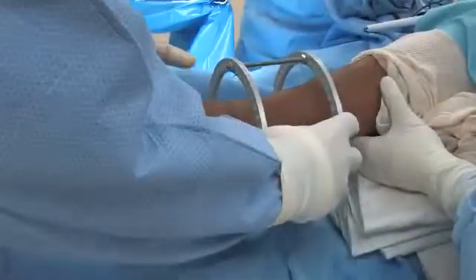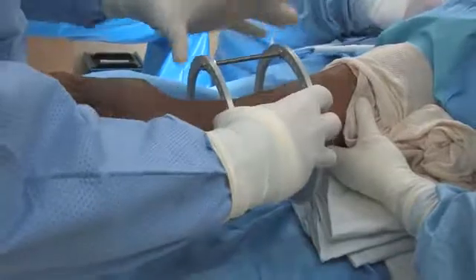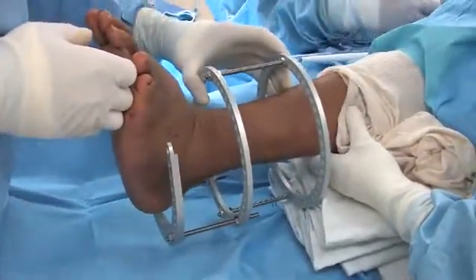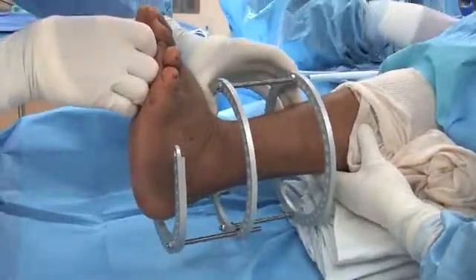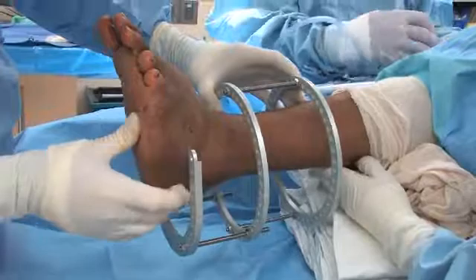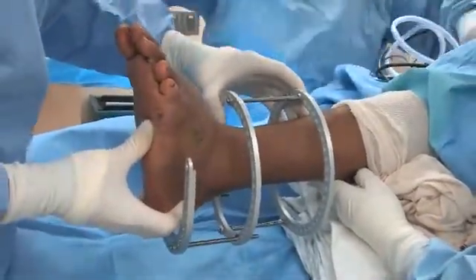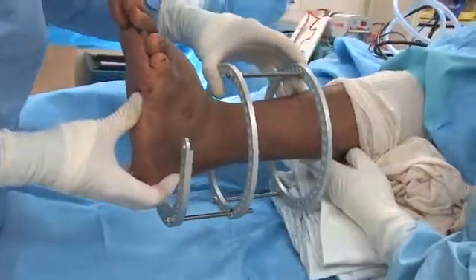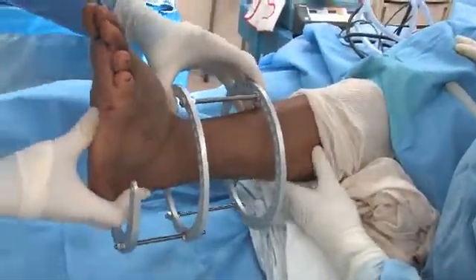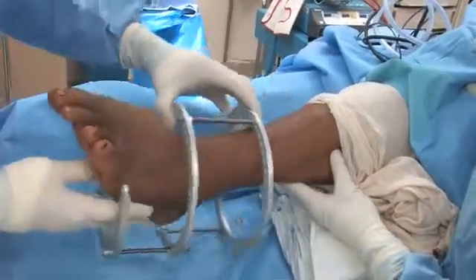Have our assistant hold the leg so that the threaded rod here and the mark on the tibia is parallel. And then what we want to do is make sure that our foot plate is equal to the bisection of the calcaneus when it's applied. It appears that we're going to have to use a lengthening of the Achilles tendon on this patient because he's got a little tightness, and this is going to reduce some of the forefoot pressure. So I'm going to need a 15 blade.